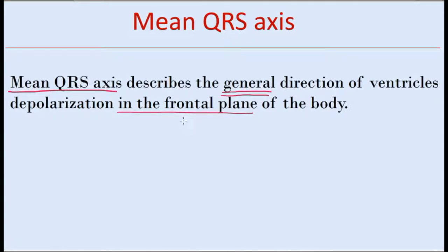Because the mean QRS axis is being defined in the frontal plane of the body, we will use only the six extremity leads which are pointed in the frontal plane.